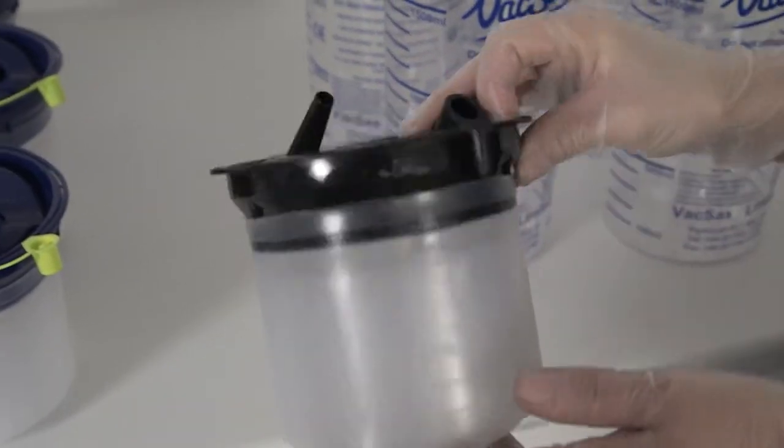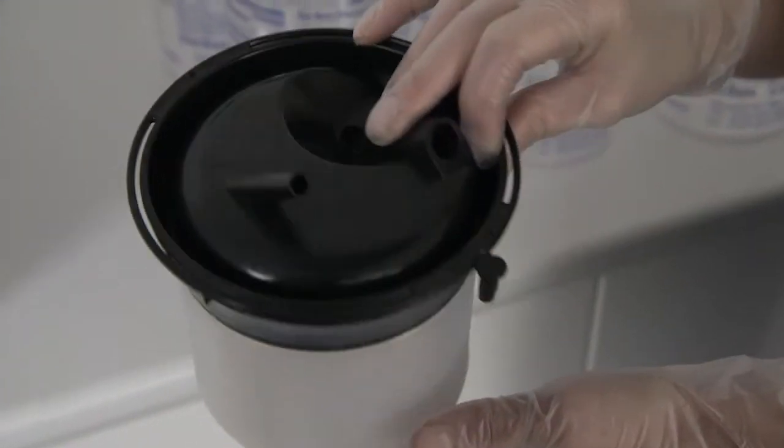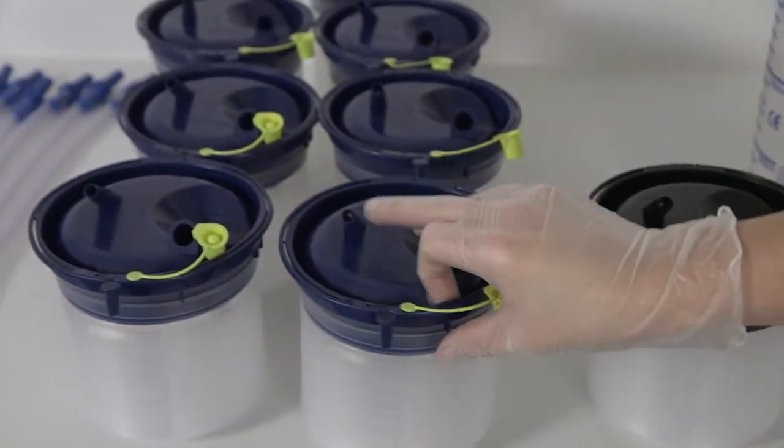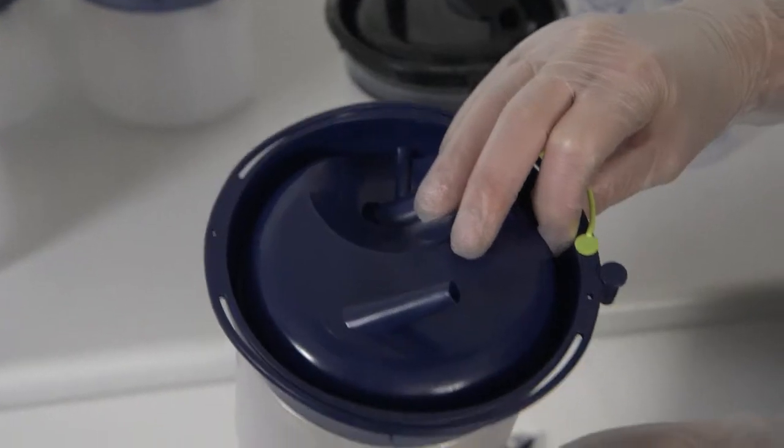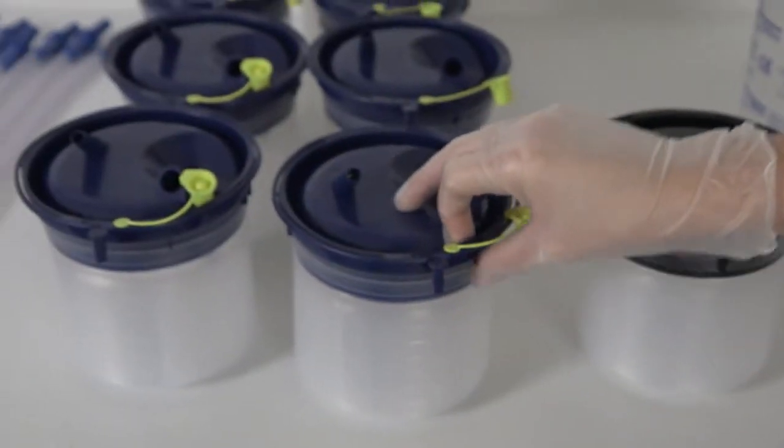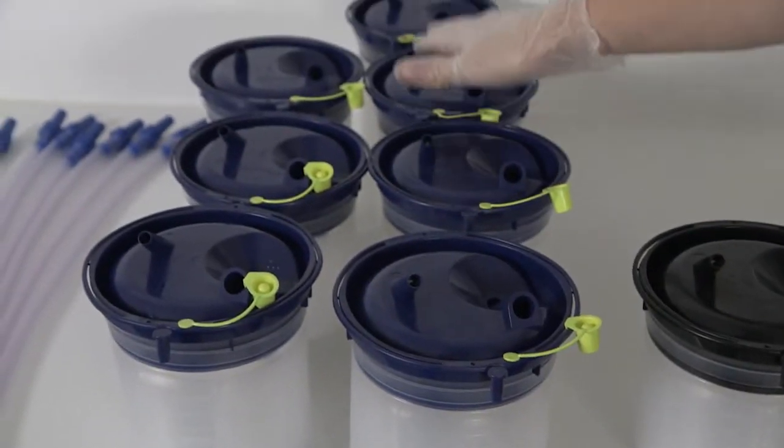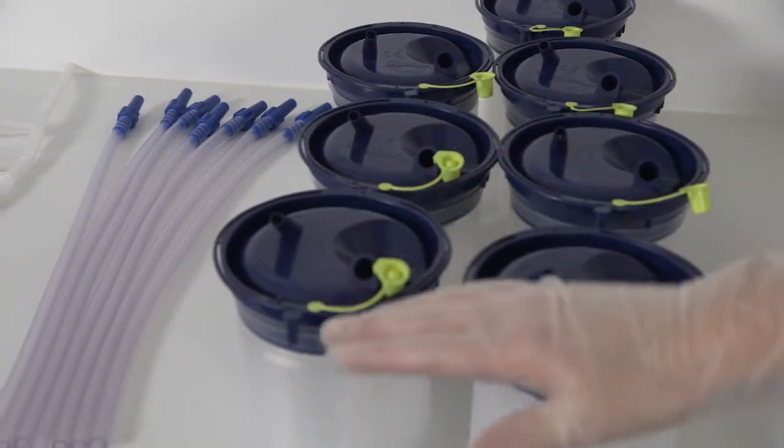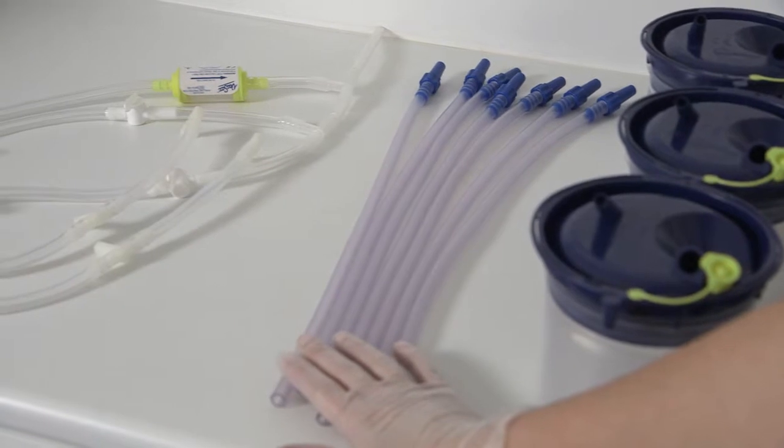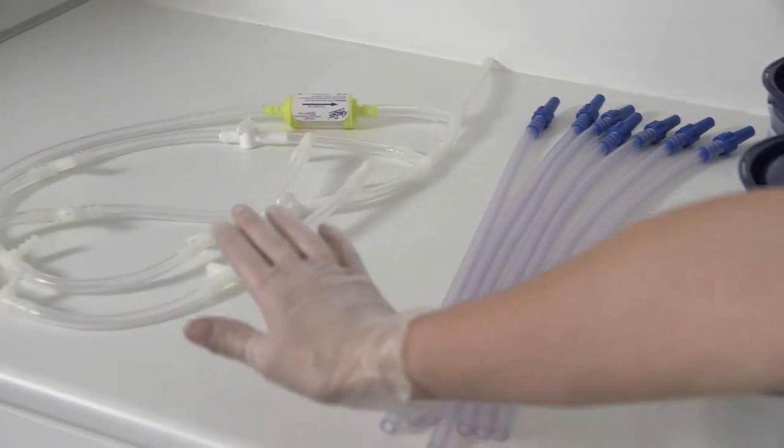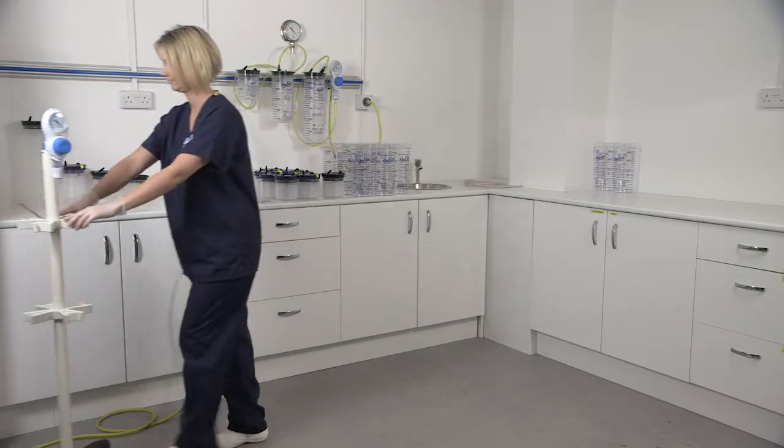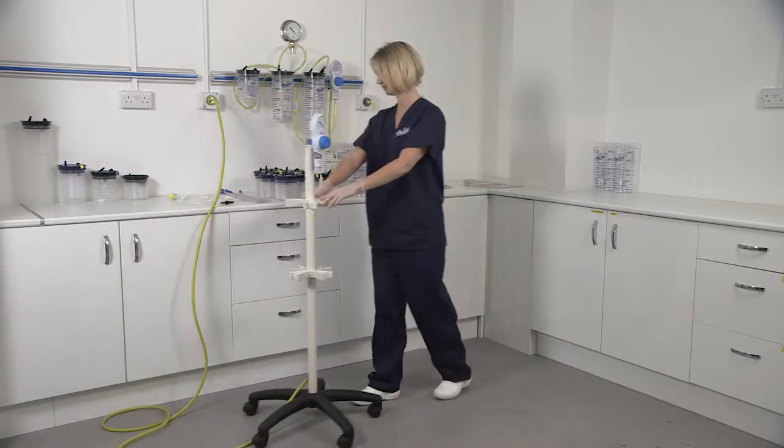One two litre standard black top liner and seven two litre cascade blue top liners. You also need seven cascade tubing sets and the reusable cascade tubing kit for the eight position cascade stand.